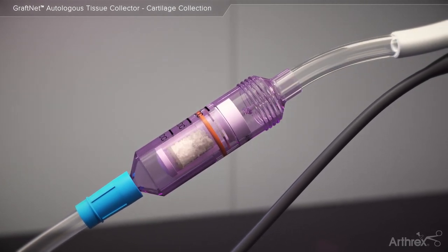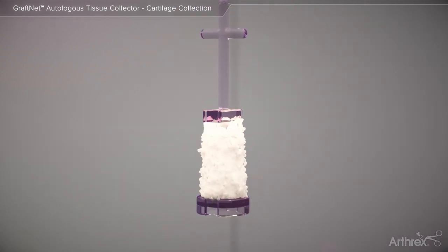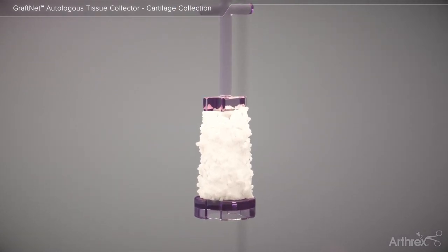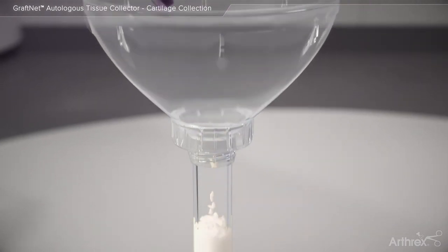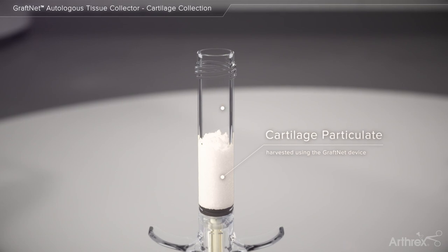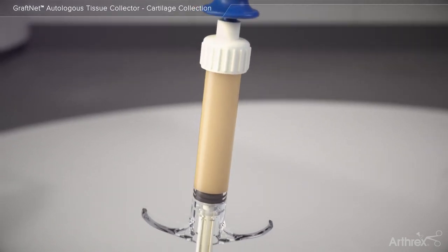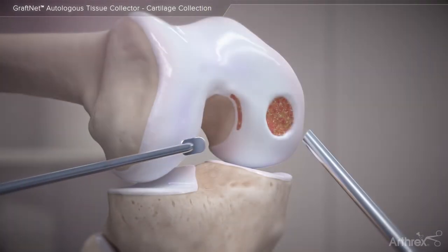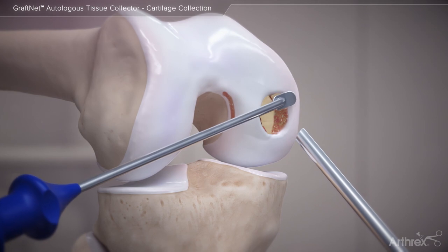The particulated autologous cartilage will collect in the GrafNet device, and the autologous tissue is readily accessible within the sterile field when the plunger is withdrawn. The autologous tissue may then be mixed with autologous fluids, then delivered to the surgical site in a single-stage autologous chondrocyte implantation.